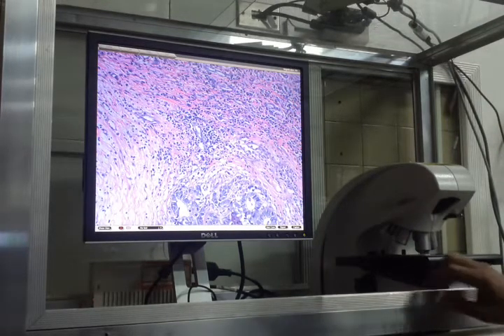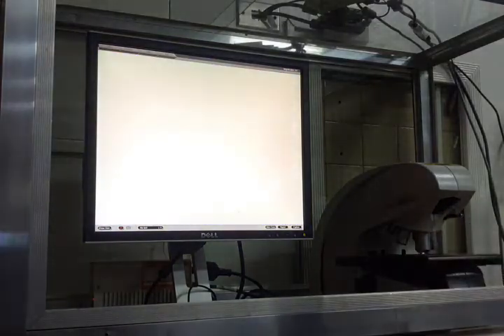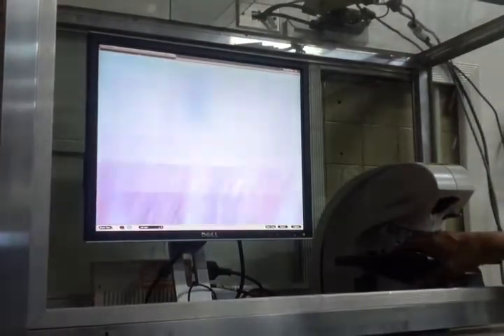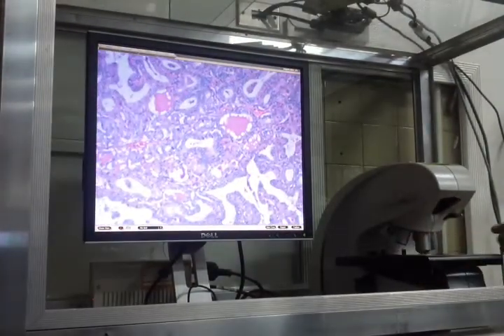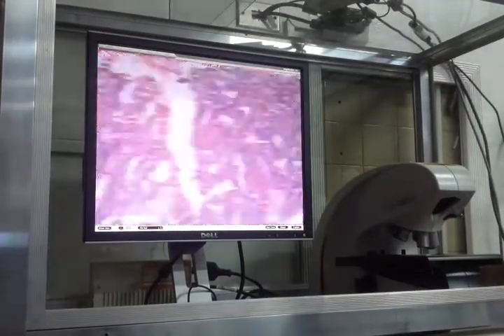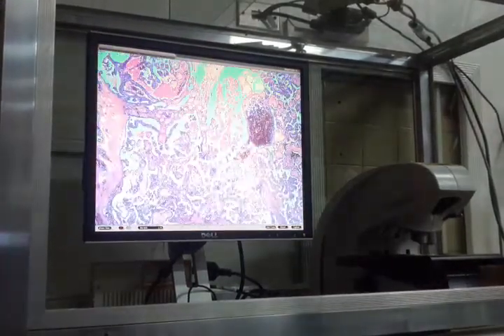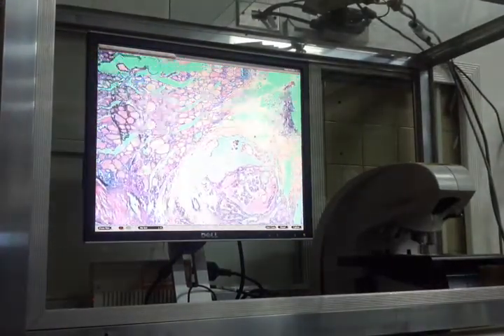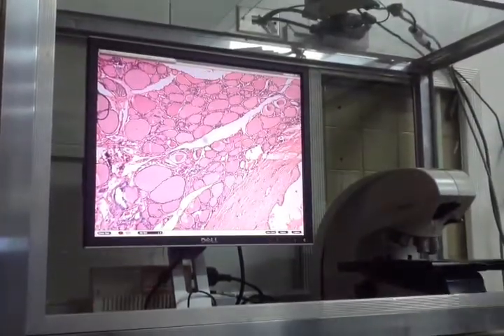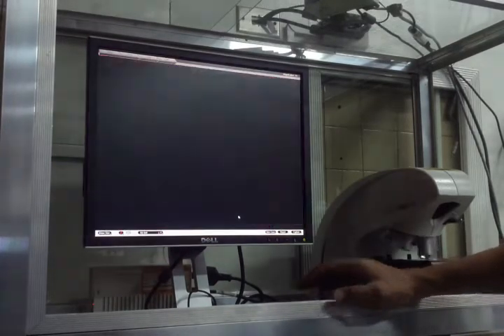Tissue of origin: glandular structures, papillary, or the mucosa of the intestine. Papillary. Page tayo, normal tissue. Okay. Normal na yan. Okay, next slide. Tissue. Higher magnification, please.